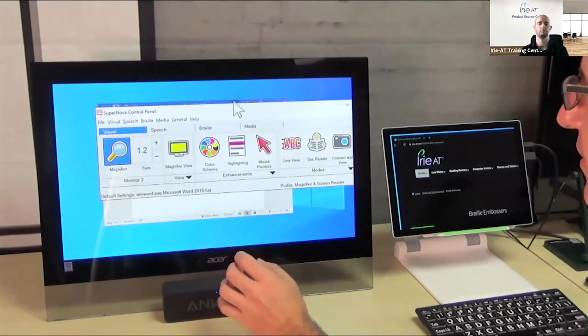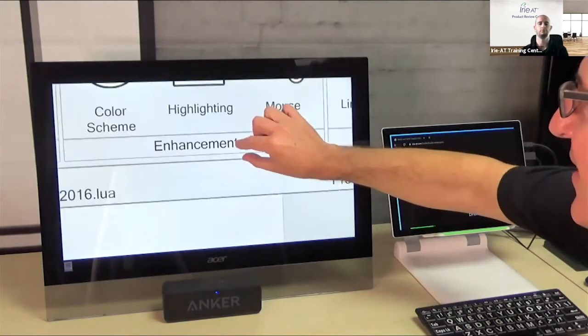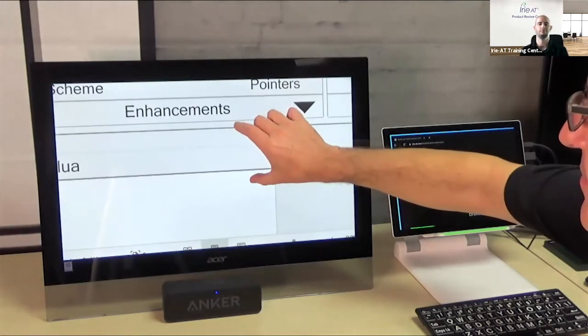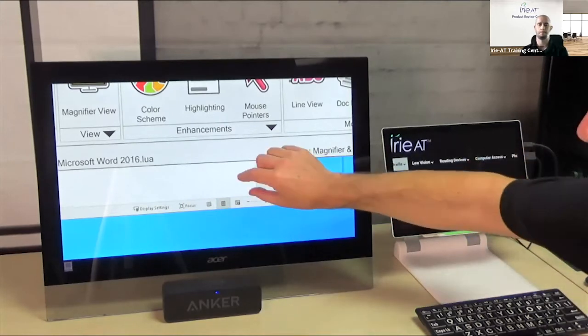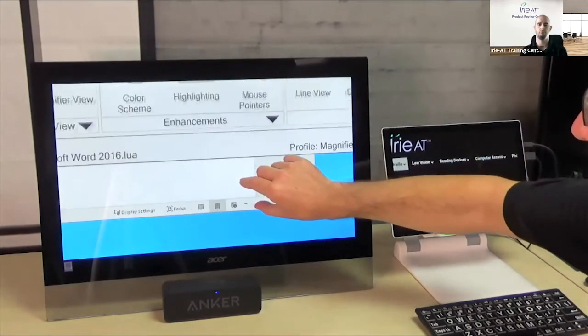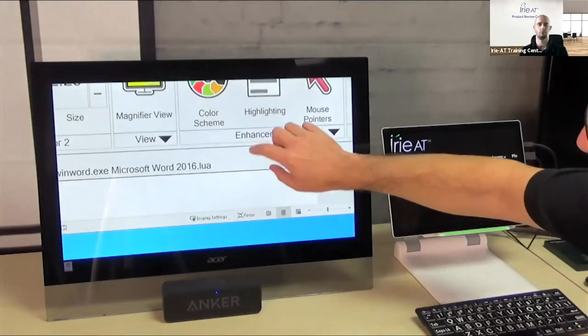Left mouse button, so now it'll work. It does pinch and zoom a whole lot better when you have the magnifier on checkbox, or when you have magnification actually on, and it should still, yeah, it's still on over here. So now I'm pinching and zooming. I can do everything here, but let's assume I didn't drag that control panel over here.